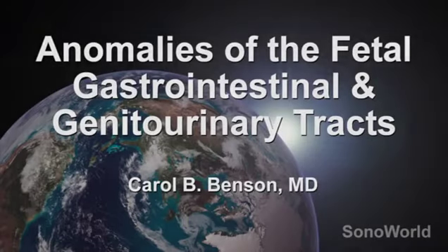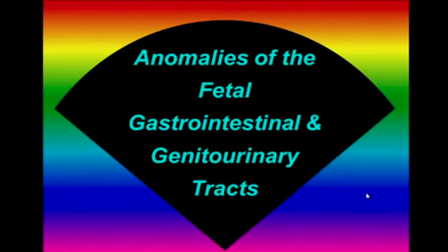I'm Dr. Carol Benson. I'm from Brigham and Women's Hospital in Boston and Harvard Medical School. The title of my lecture is Fetal Gastrointestinal and Genitourinary Tract Ultrasound. My lecture today will cover anomalies of the fetal gastrointestinal tract and genitourinary tract as found by ultrasound.